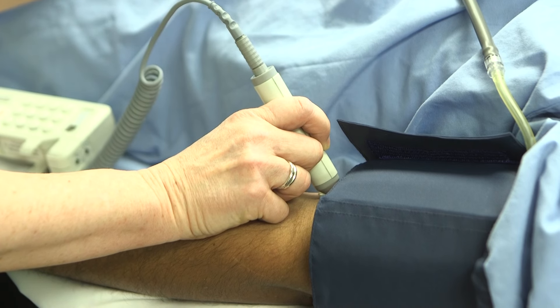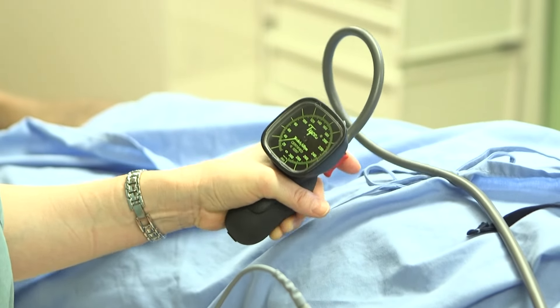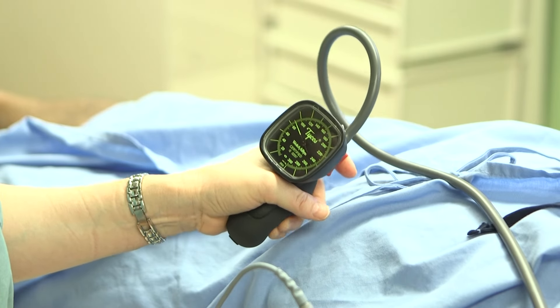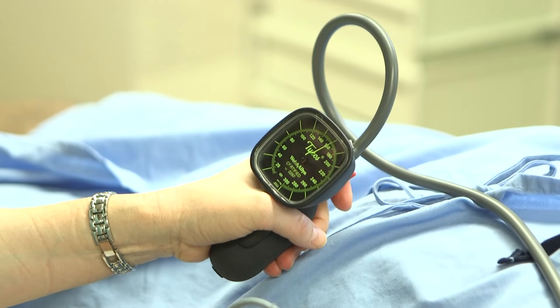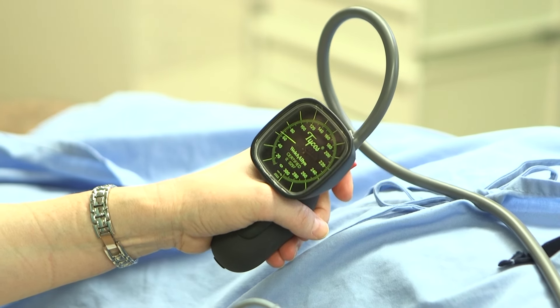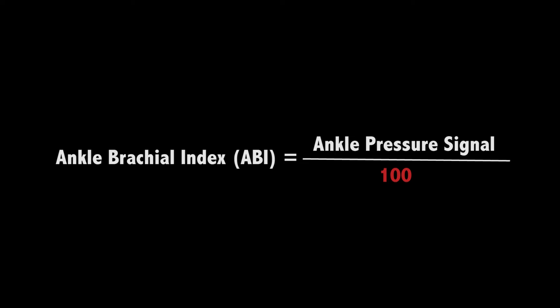Now what we want to do is inflate the blood pressure cuff to eliminate the signal. Then we want to gently deflate the blood pressure cuff until we can hear the signal return. We notice the signal returned around 100. The return of the signal is the brachial measure, or the denominator for the ankle brachial index.